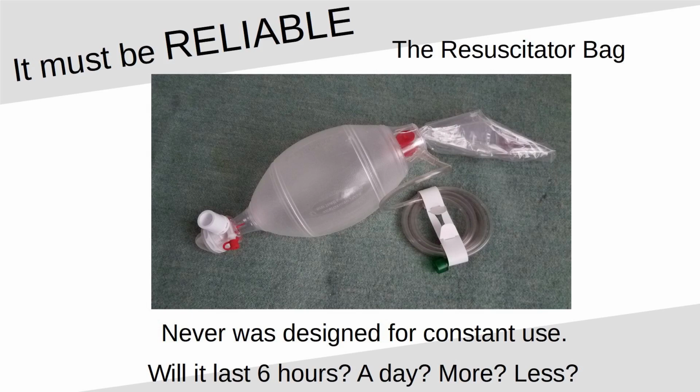Will it last a day? Will it only last half a day? One big test we have to do, and other groups have to do, is to see exactly how long one of those bags will last, and it's probably manufacturer dependent. And once we know that, we'll know whether these designs are viable or not.